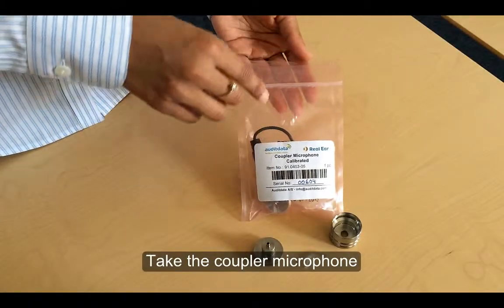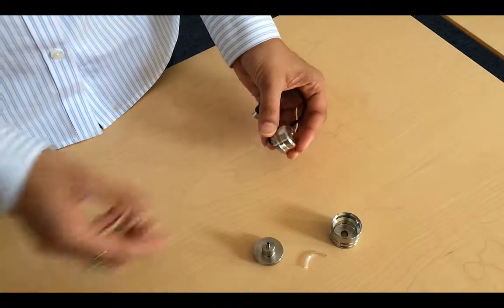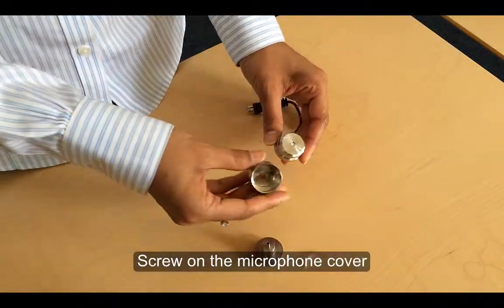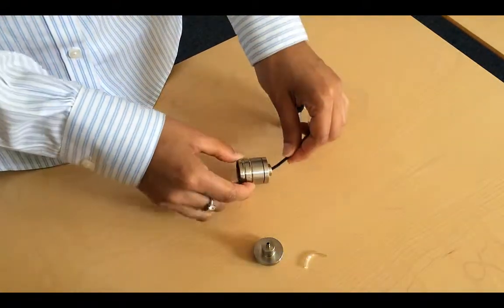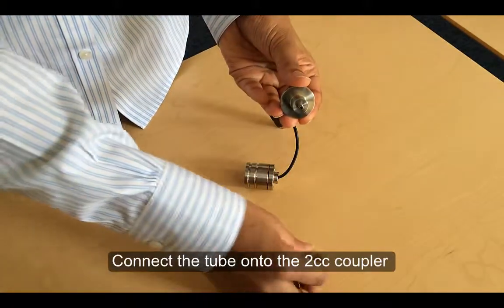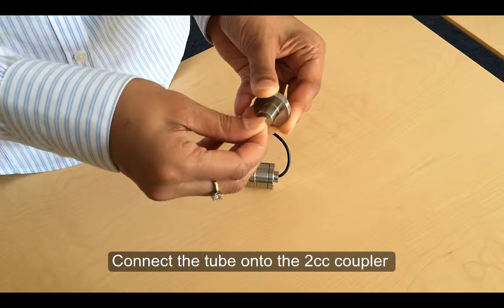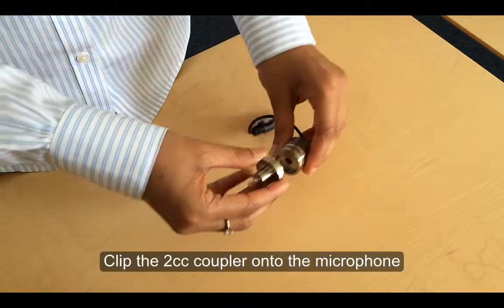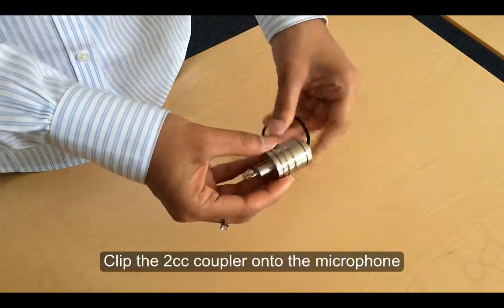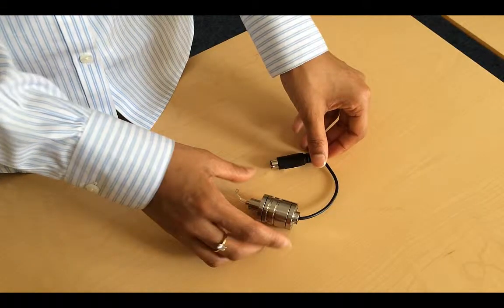Locate the coupler microphone in the accessories bag. Now screw on the microphone cover. Connect the tube onto the 2cc coupler, and having done that, clip it to the microphone. You can clip the 1cc coupler and button receiver coupler instead of the 2cc coupler as appropriate for your use.